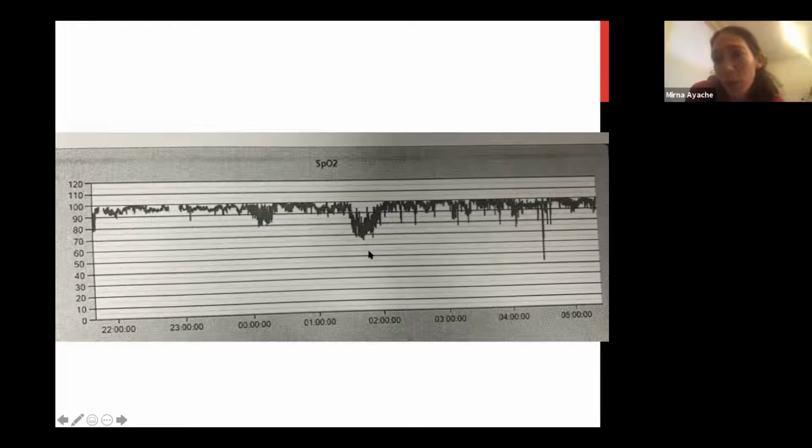Yes, thank you so much. So absolutely. This is pretty much a positive saturation waveform for sleep apnea, right? There's nothing that can give you a drop and a resaturation like this other than sleep apnea. Whether it's obstructive or central, we can't tell for sure. It's looking more obstructive here. These are probably REM periods with worsening of obstructive sleep apnea.